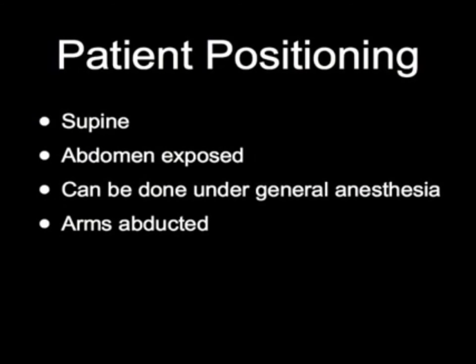Patient positioning: supine with the abdomen exposed. This can be done under general anesthesia. Arms should be abducted to allow access to the abdomen.